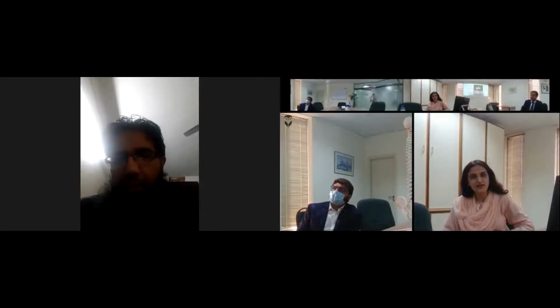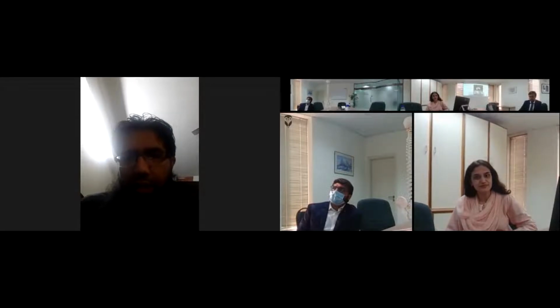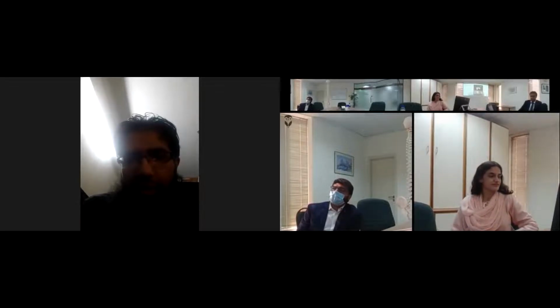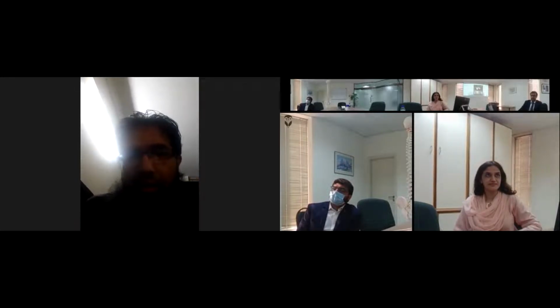But if you could describe a little bit, what is DSA? As in, what does it do? You can take the background image, and if you give a contrast, you can subtract the background image from the contrast image itself, and that gives you details of where the contrast has gone. So it's just a form of subtraction in angiography where you can subtract a background image from the current image acquisition.